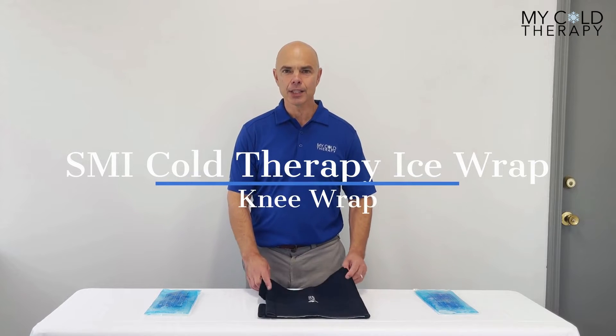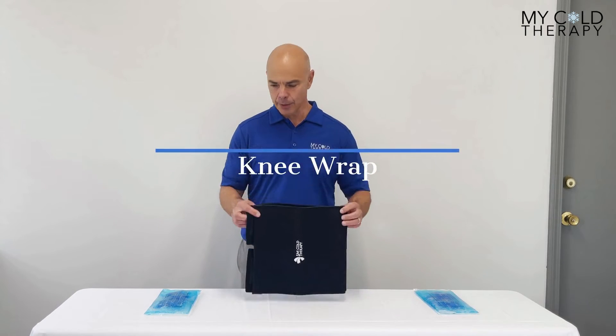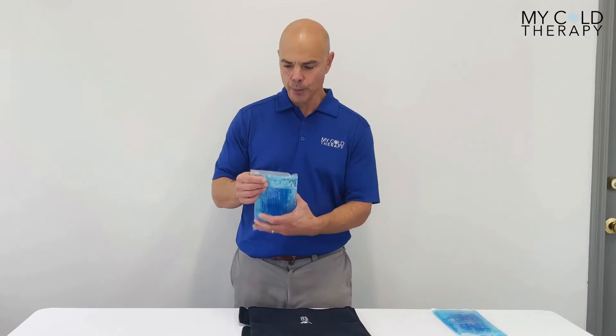This is Steve from iColdTherapy and today we're going to go over the SMI Cold Therapy Wrap. This is what it's going to look like when you get it in the mail. It comes with two gel packs.